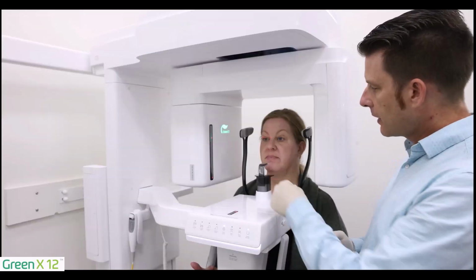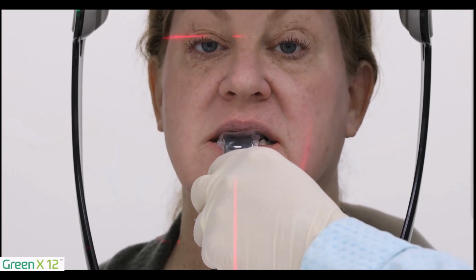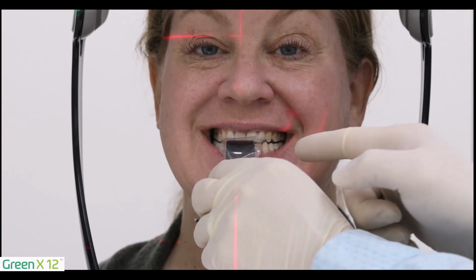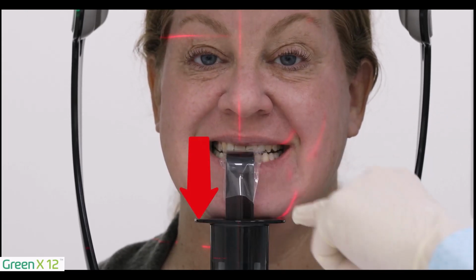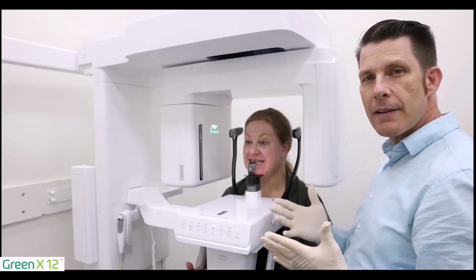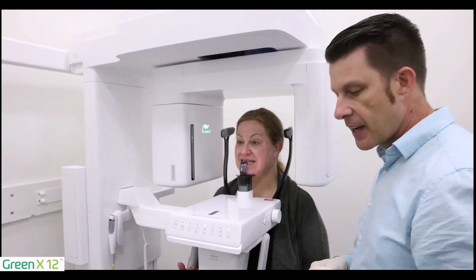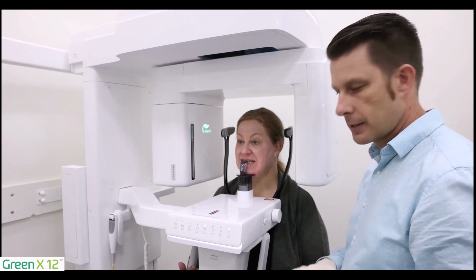At this point, I'm going to have the patient open and go ahead and move forward and bite on the bite stick. Smile really big for me. I can see that the patient's in the bite stick groove, and I want to gently push on the bite stick to ensure the patient's chin is firm on the chin rest. Once I have the patient in the device, I'm then going to work with my positioning beams to make sure they are properly positioned.